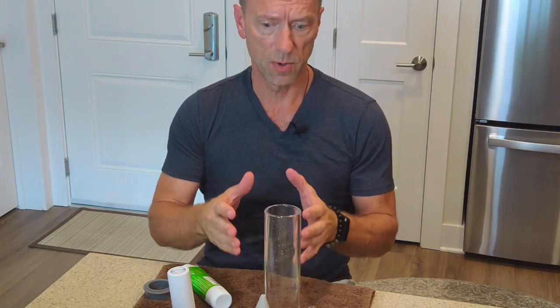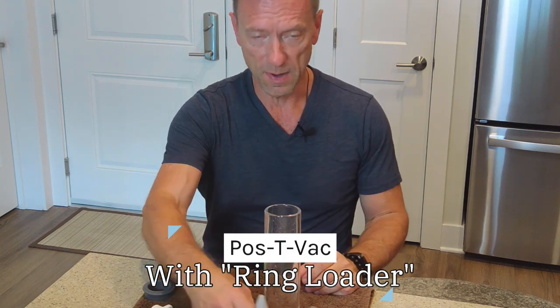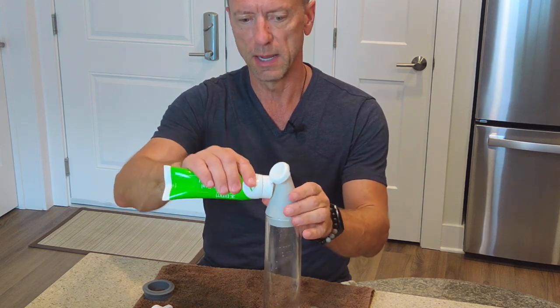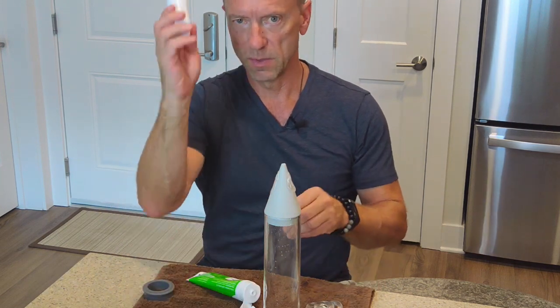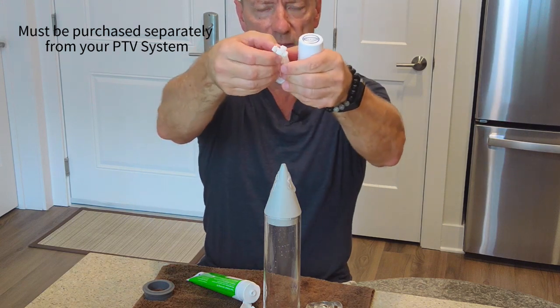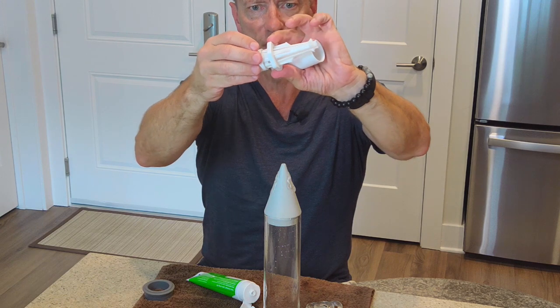Now finally, I want to show you how to use the Pos-T-Vac ring loader when you load the tension ring onto the cylinder. We've got the same cone that we're using. I want to lubricate the cone, and I also want to make sure I lubricate the inside again of the tension ring. Then with this ring loader, you can see if I pull this apart, it's got essentially fingers, and I just want to make sure you can see those. There are 4 fingers. There's this hex nut that comes down here.